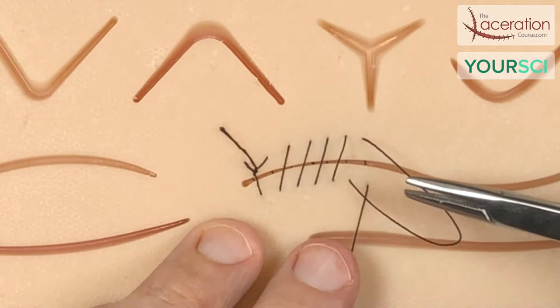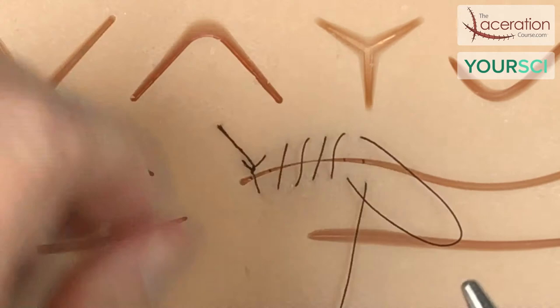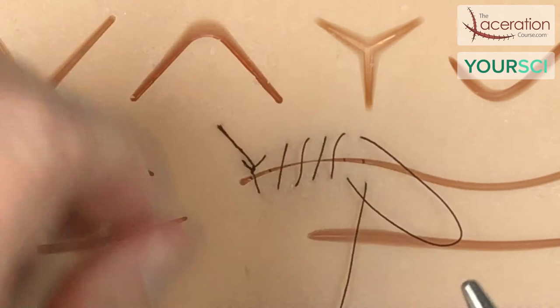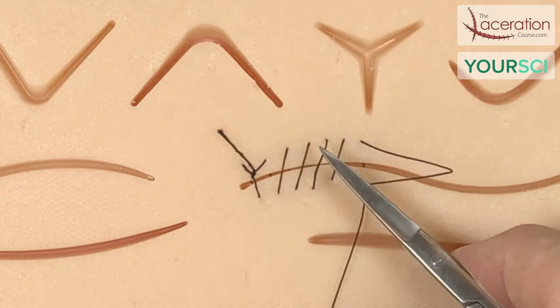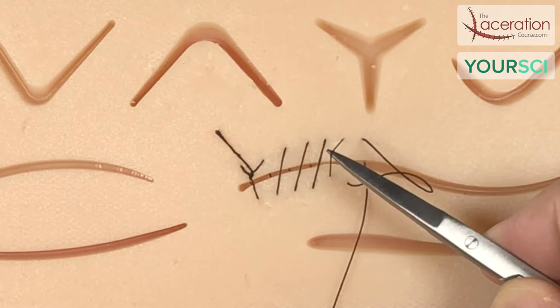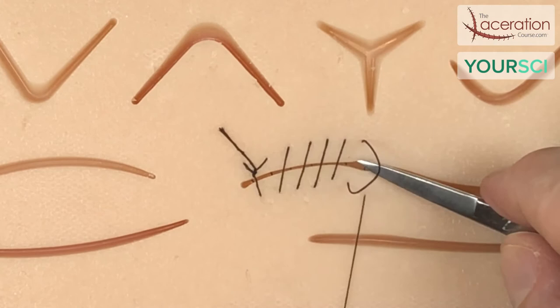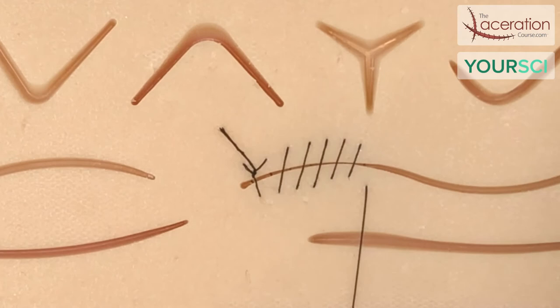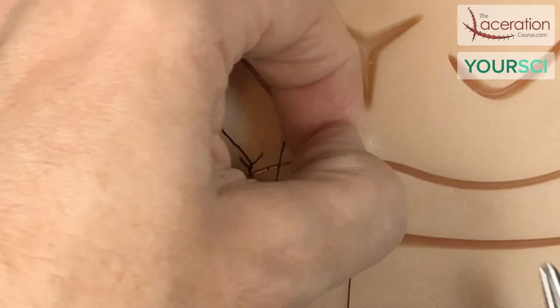Now I'm going to show some things that you may encounter. Sometimes you may get some laxity or over-tightening in the run of your suture. What you can do is use a few extra instruments — let's say this suture is pulled up like that. I can come over here and kind of pull that down. Sometimes you just have to play around with it and get things to lay down nice and flat, nice and smooth. Again, what's our goal? Symmetry. That's what we're wanting — for things to be symmetric so that we can give these wounds a proper chance at healing.